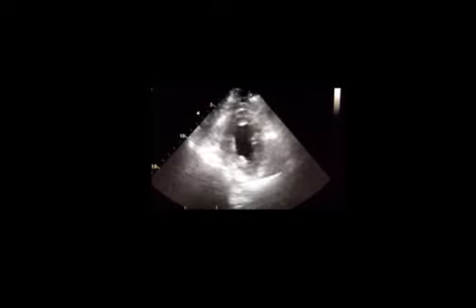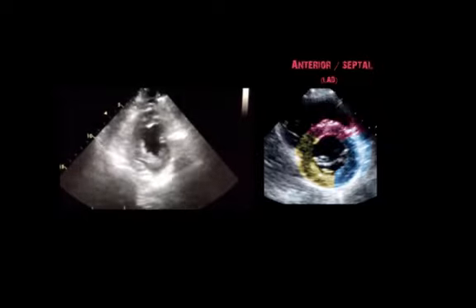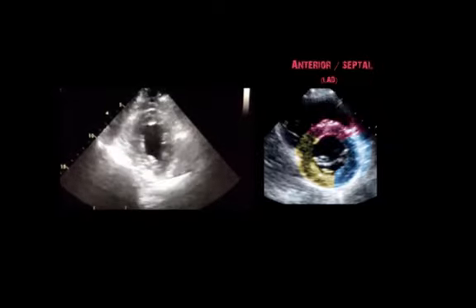Here's a parasternal short view of the same patient. Look at the anterior wall on top of the image. Clear, right? Sometimes the abnormalities will not be completely evident in one view, but integrating the information and looking directly at the same regions in each of the 3 views, parasternal long, short, and apical 4-chamber, will allow you to pick them up.